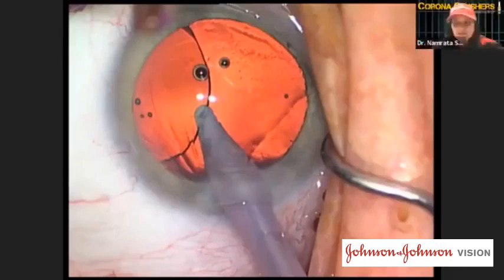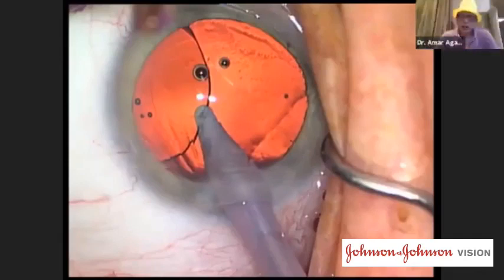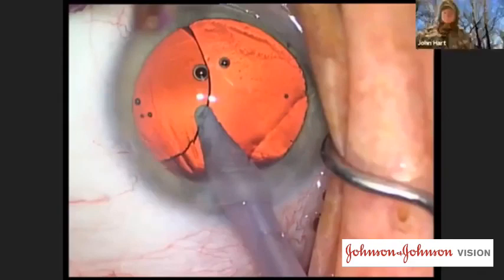There is a question which says, what about pinhole pupilloplasty in those patients who are on URMX or who have a floppy iris? Are there any different problems with that? Actually, I have patients with iris prolapse, and it helps a lot, because when these floppy irises are there, suppose at the end of it, when it's flopping a lot, it's not good. So I always do a pupilloplasty and make things much better.